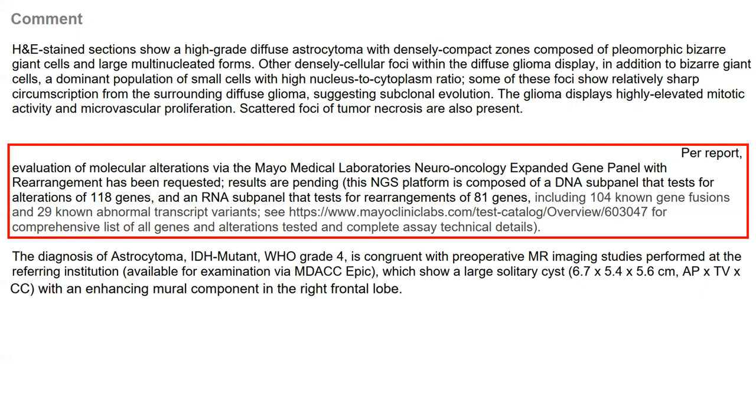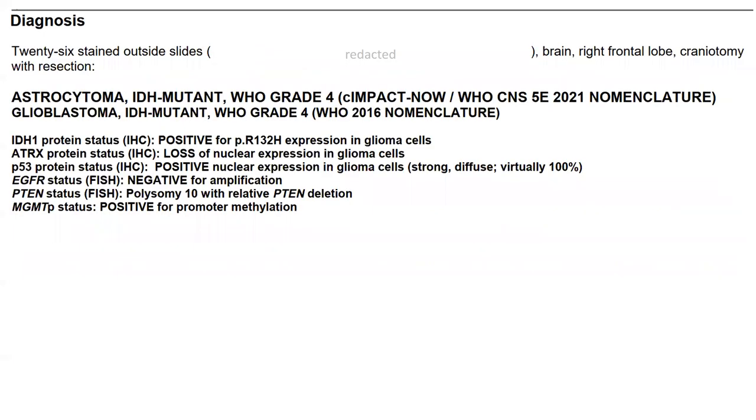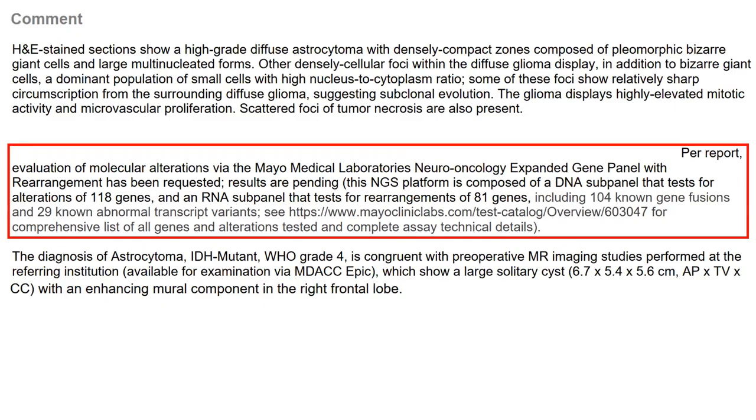The point here is, why did I do that? I did this because this patient has had piecemeal testing. That's what you see here. This is piecemeal immunohistochemistry and some FISH studies. That's all. This patient has not had comprehensive NGS. What I'm doing is telling the neuro-oncologist exactly what has been done on the outside. This is true NGS. This means that we will probably be able to get a hold of this report, and we do not have to repeat NGS at MD Anderson Cancer Center. It's the communication with the neuro-oncologist, everything like that.